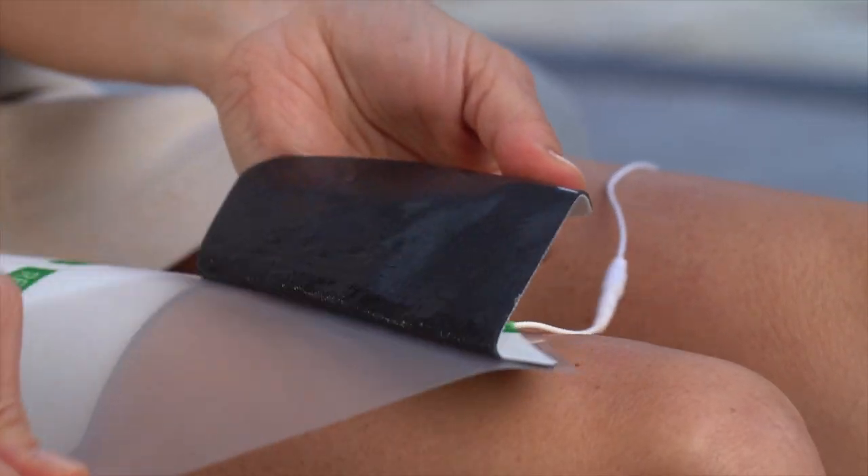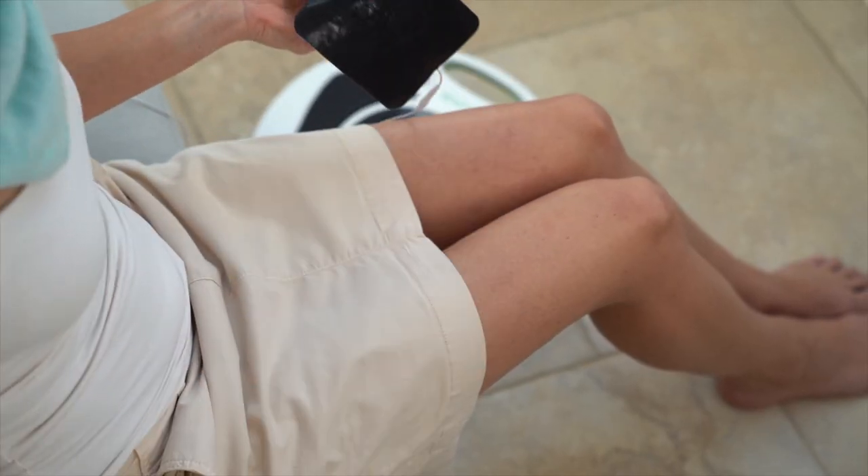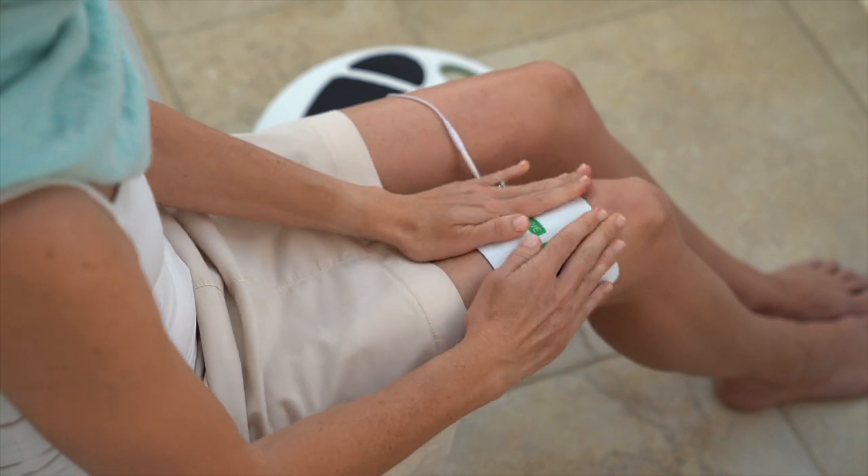Remove the plastic liner from the arthritis pads by peeling it off carefully. After use, always put the pads back into the liner to store and protect your pads.